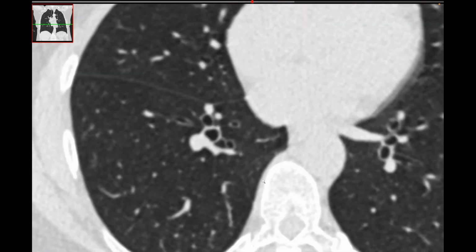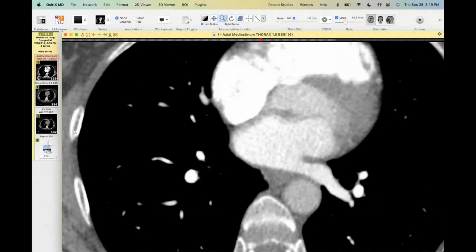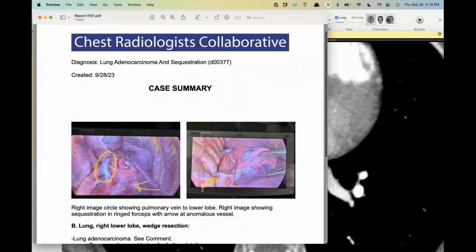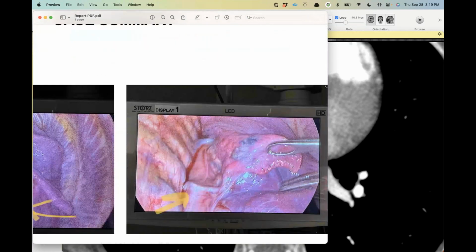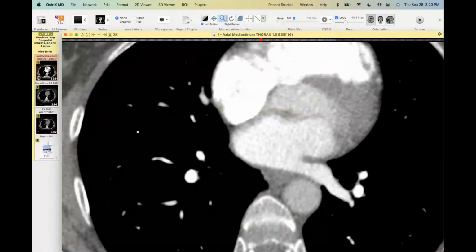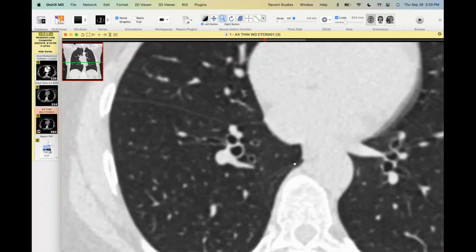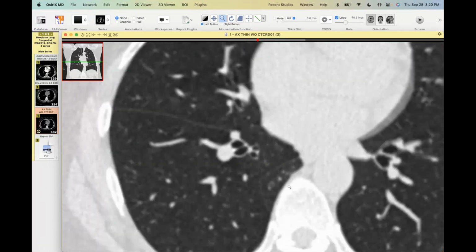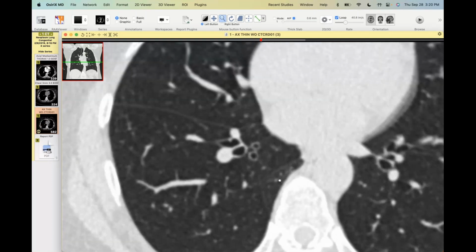She ended up seeing this in the operating room, and it was a little sequestration that she took out as well. I'll show you a couple of the images from the intra-op. This is the basilar segment, the basilar pulmonary vein to the four basilar segments, and this is the sequestration tissue that she has in the loop forceps here, and that's the little vessel. It looks a little bit bigger on this, and it looked a little bigger on the non-contrast study than on that original contrast-enhanced study from a couple years ago. That's not a tiny little vessel there, but it was fairly mobile, and this was a reasonably complete fissure, so she was able to take that out. On path, they thought it was a sequestration. So just a bit of an unusual location.